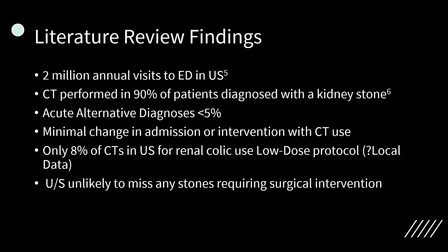And lastly, they noted that ultrasound is unlikely to miss any stone requiring surgical intervention. So if we're not seeing that moderate or greater hydro, even if they have a stone, it's not causing hydro, it's probably small, and they'll probably be able to pass it on their own. As long as you get their pain under control, they may not need further imaging.